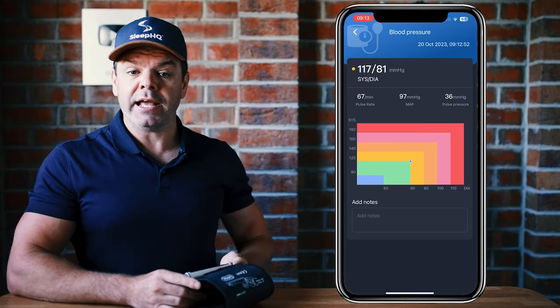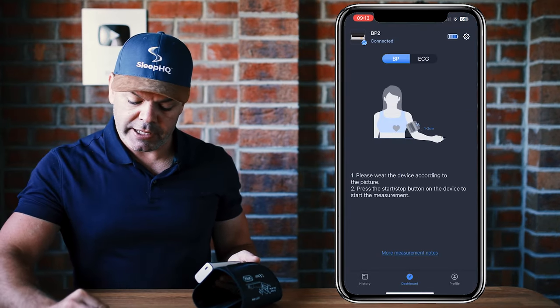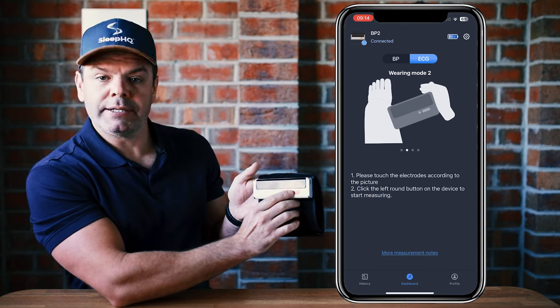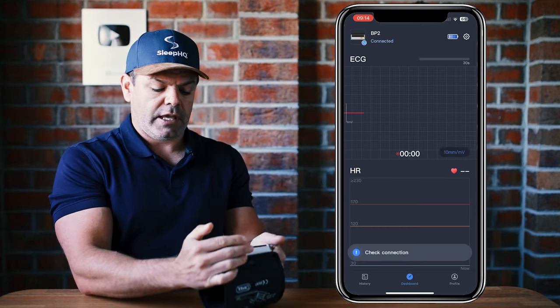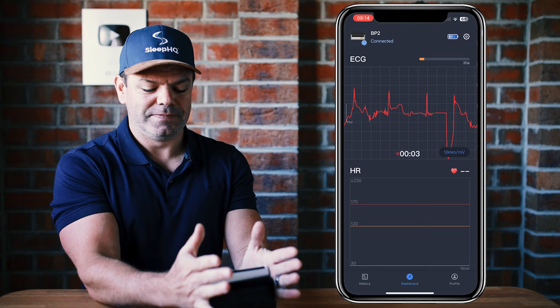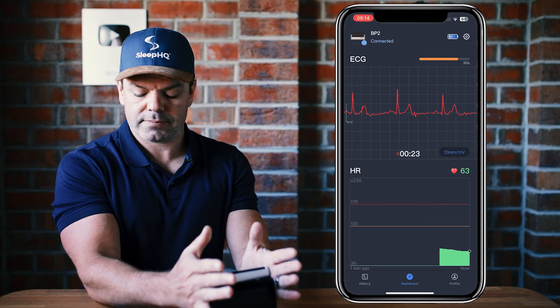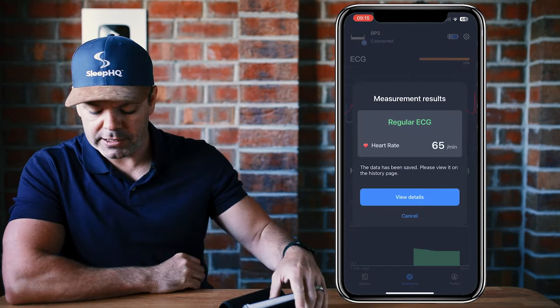The other thing you can do with this cuff is take an ECG measurement. On the dashboard, click ECG at the top. This time instead of pressing start, press the little button to the left with the three vertical lines. Click that and hold the cuff in the palms of your hands on the two metal plates. Stay nice and quiet and still. Done — regular ECG, heart rate 65 beats per minute.